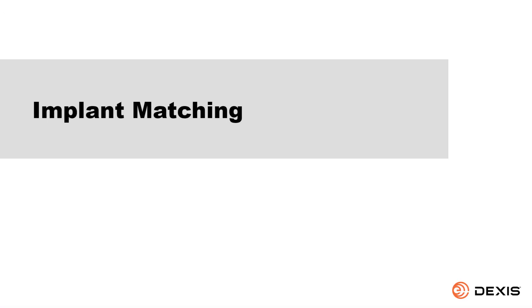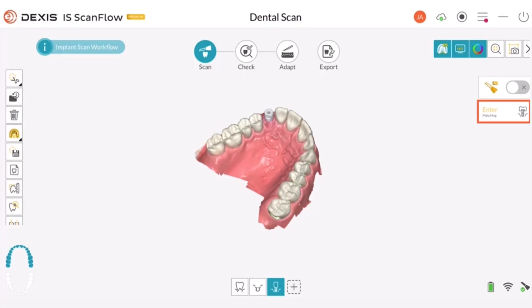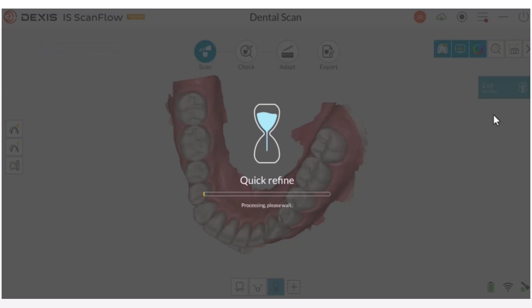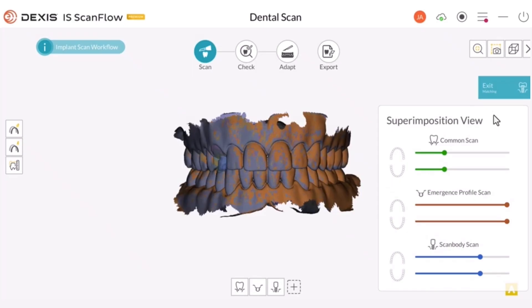Implant Matching. Click Enter Matching. Implant matching allows you to superimpose all your scans — common scan, emergence profile scan, and scan body scan — to make sure all scans are aligned in occlusion with the common scan. If the auto-matching portion did not align the scans to your satisfaction, you can use point-based matching to manually align the scan.